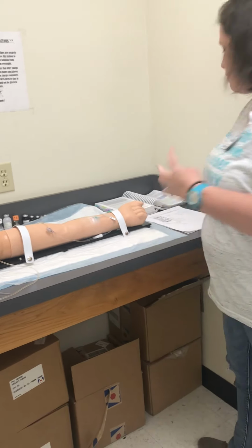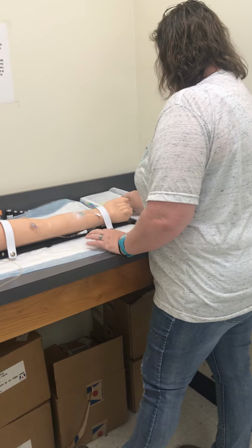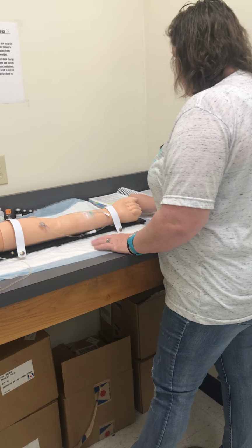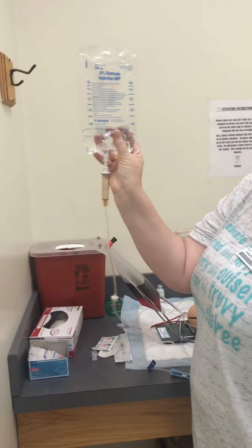And we're going to give it over 4 to 5 minutes. That is a safe way to give it according to our IV drug book. It can be given undiluted, so we're good with that. It is compatible with what we have running, which is the D5W, so we're good with that.